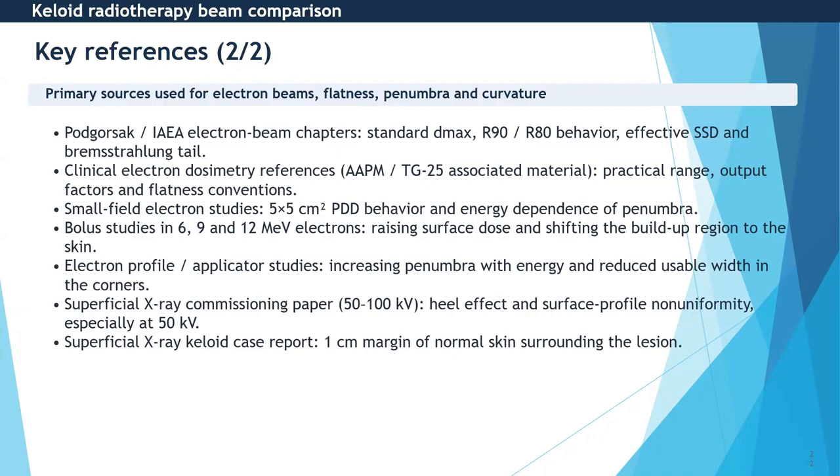So is there any, from a practical point of view, is there any difference between the amount of time it takes you to deliver, say, 10 gray at 60 kV versus 10 gray at 6 MeV? Are they about the same in terms of amount of time taken? The dose rates would be similar, but the time taken would normally be shorter with the superficial unit because it's much easier to set up. And the oncologist would come and actually look and say, we'll do it there. There would be an area marked. The oncologist would come and confirm that the setup was correct.